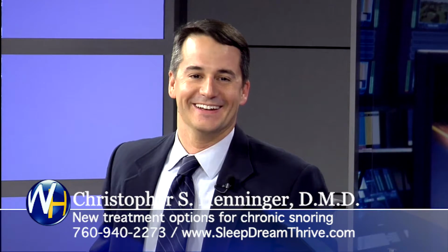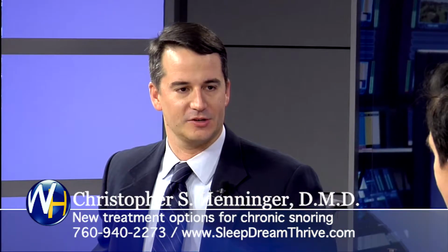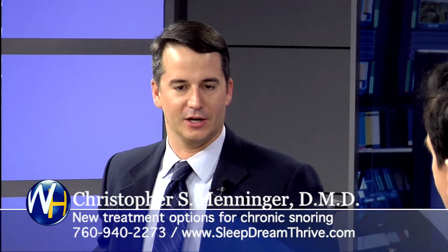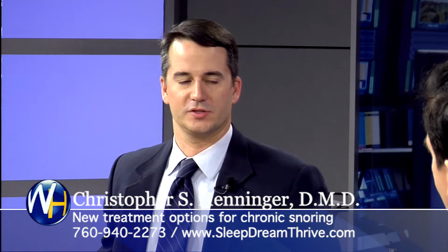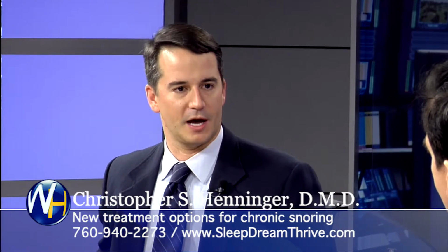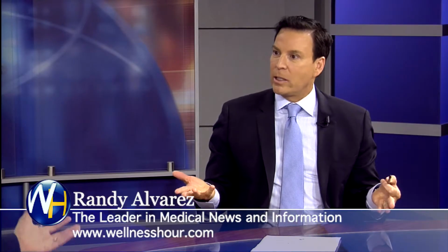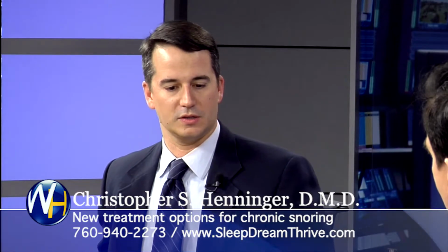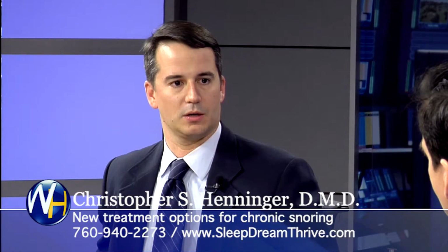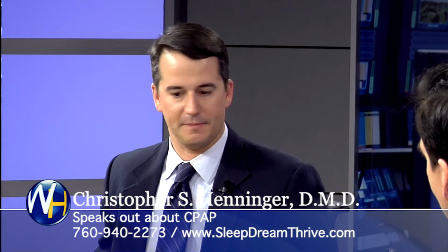No, they didn't. And I said, there is a solution. It's an oral appliance. It advances your mandible forward. And you don't have to wear CPAP. And again, I felt like this is a person that should know the treatment options for sleep apnea, an anesthesiologist. And it's covered by medical insurance. It is, absolutely. And it's covered by Medicaid as well. So these aren't typically out-of-pocket expenses like your CPAP. The medical insurance will pay for you to be on CPAP. They'll pay for you to have an oral appliance because they want you to be healthier.